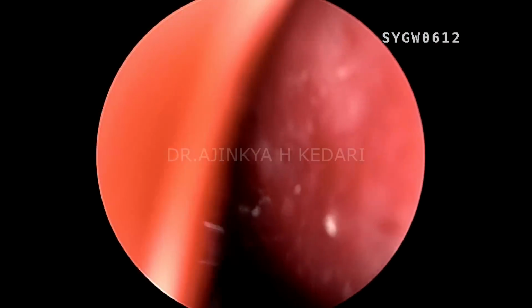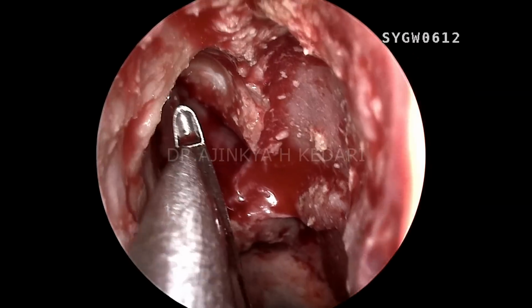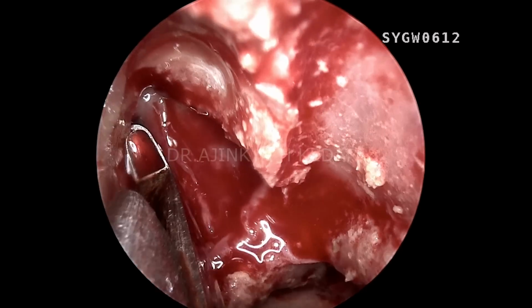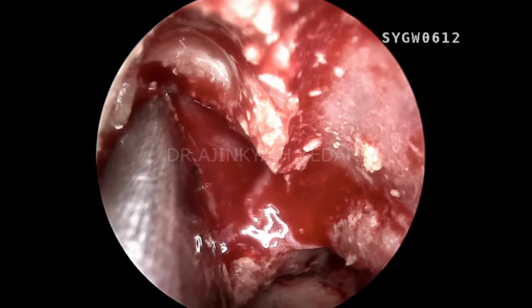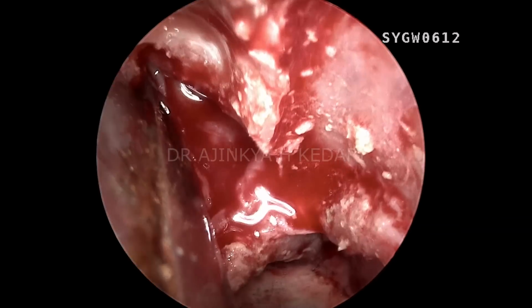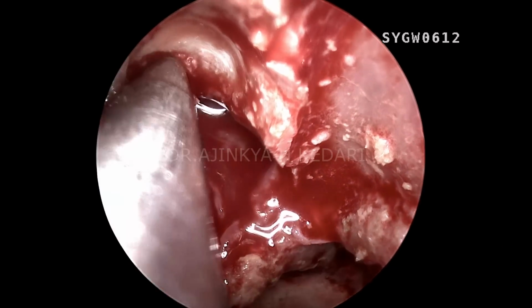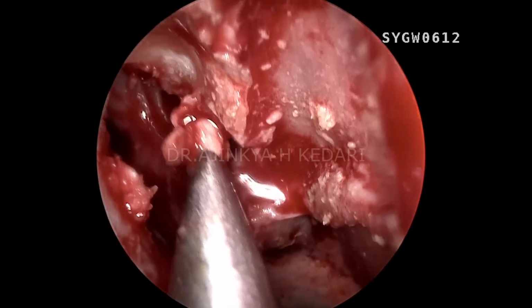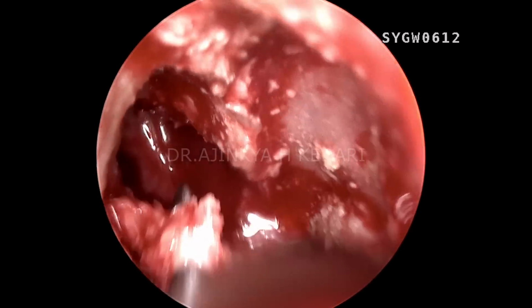So you can see I'm coming back onto the bone punch, taking off the bone. I'm using a combination of both the bone punch and the drill. You can see how the bone punch is easily allowing me to take off all those bony parts which are more lateral. If you have an angled shaft burr, you can easily drill on that, but you can see this bone punch is actually helping me a lot as well.